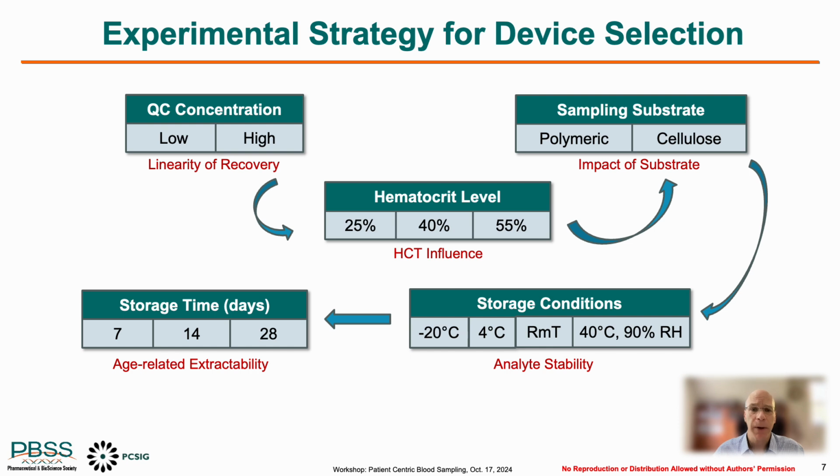So with this experimental design, we can examine the interrelationship between hematocrit level, analyte stability, and age-related extractability, while also determining the role that the sampling substrate might play in either exacerbating or mitigating each of these occurrences.